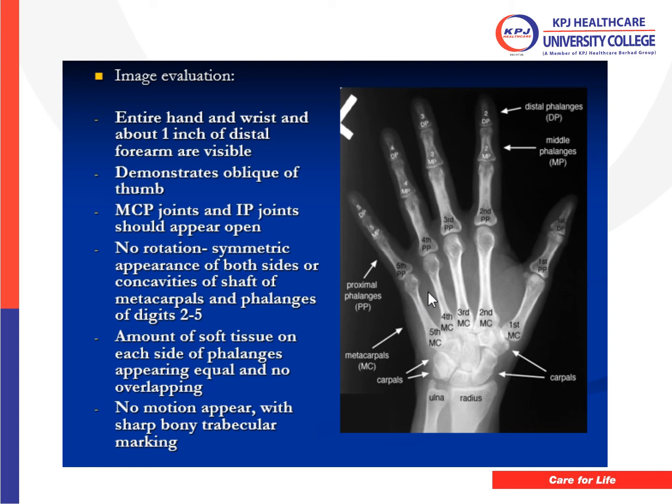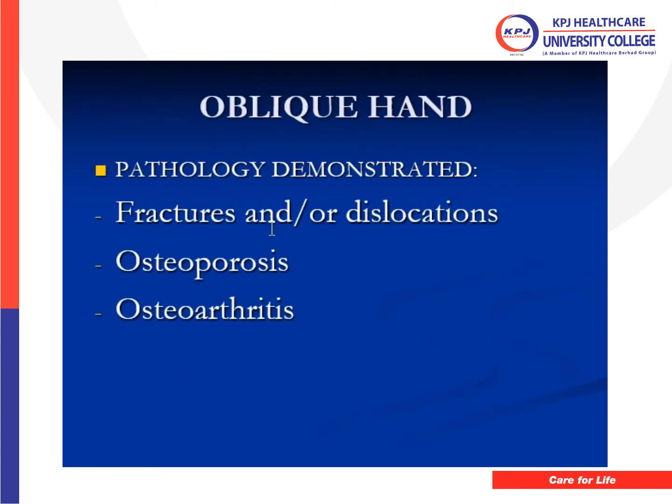Otherwise it will be blur. Alright, go straight away to the oblique. Pathology demonstrated: same thing, fractures or dislocation, osteoporosis or arthritis are acceptable.